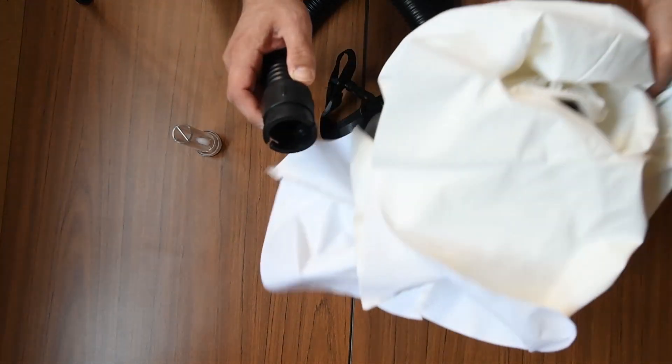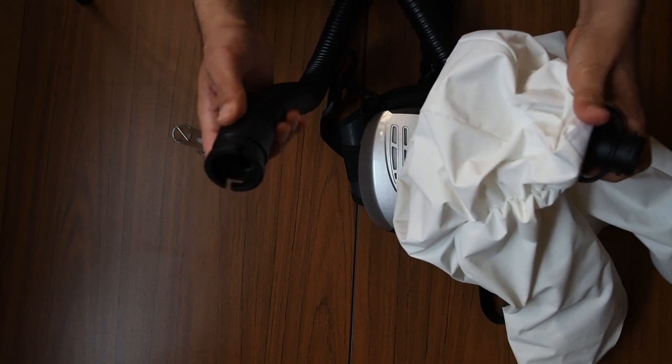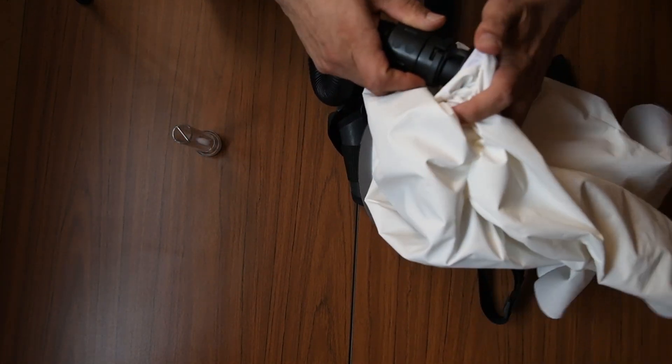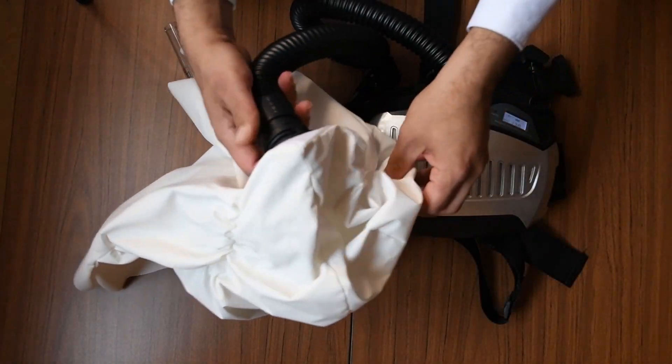You can also attach the end of the flexible hose to the headpiece like this.